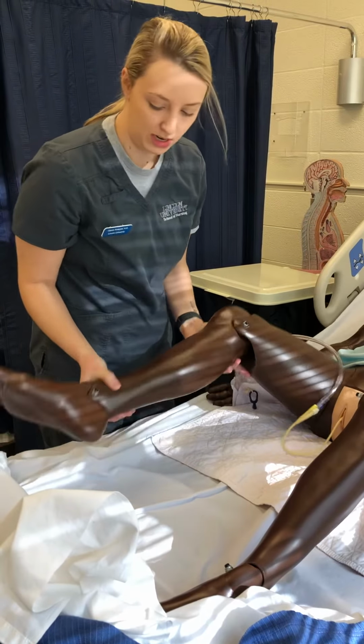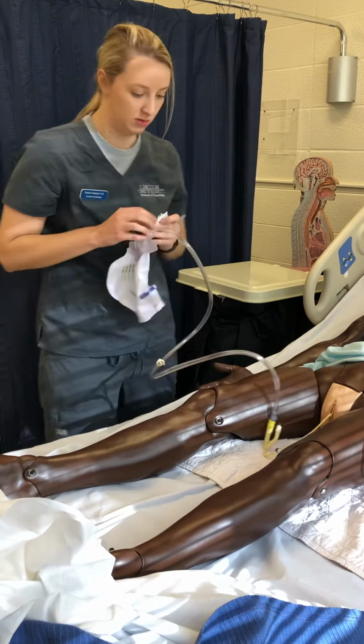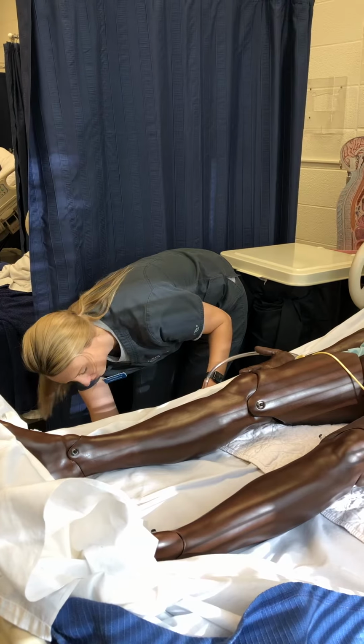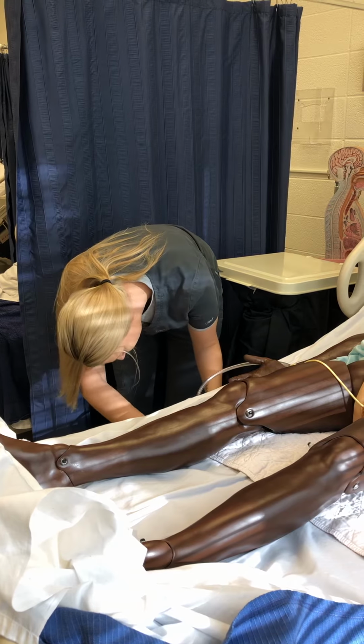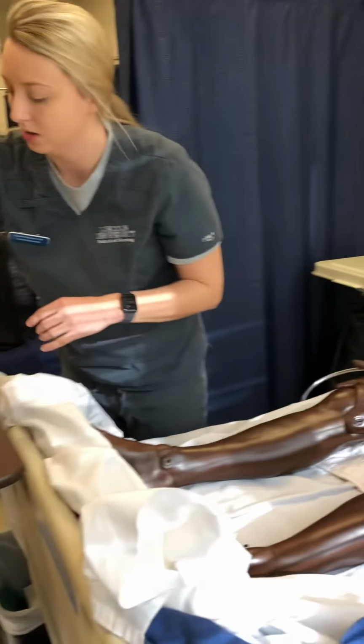I lay my patient back down. And I'm going to hang my bag onto the rail. And then I'm going to tape it to the thigh.